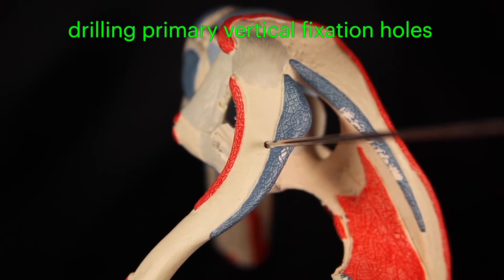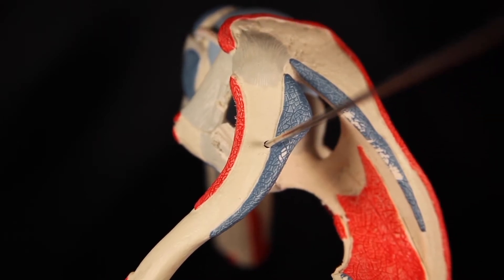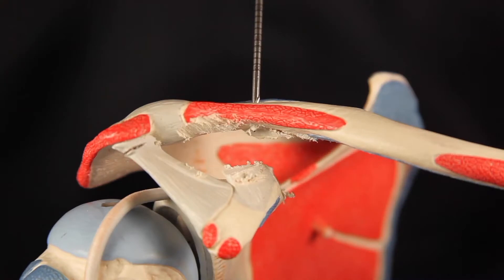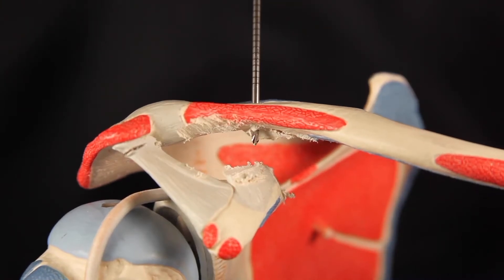A 2.4 millimeter drill hole is made in the midline of the clavicle, directly in line with the base of the coracoid, approximately 35 millimeters from the end of the clavicle.